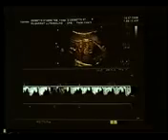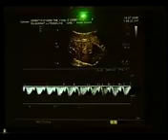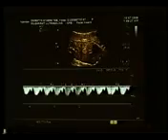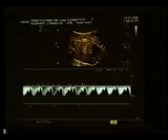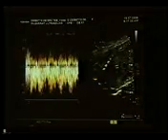Now, just see what I do. The same patient I'm doing, and you can see the A wave is absent. The A wave is almost causing reversal or absence of flow. The same patient, when I change from fetal heart to the normal OBS setting, because now I'm going to do OBS, the whole scenario changes. This is a word of caution which I have pointed out to AIU people, the section meetings, that look, you are overblowing the whole situation and saying you can diagnose tricuspid regurgitation at 14 weeks. No, there is a problem there.